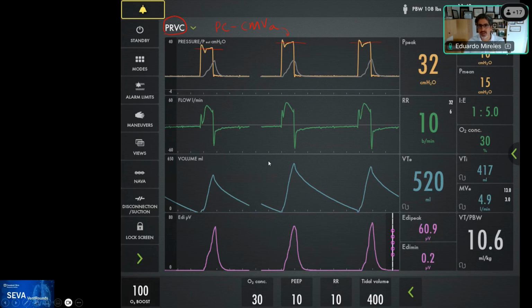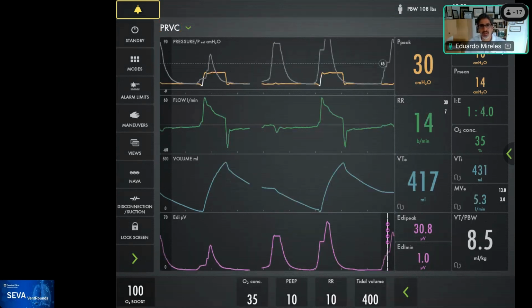So now let's go to our next image. This patient, we placed the catheter because the goal of the team was to get her to comfort, and as she was coming out of the level of sedation, now you can see her doing the activity on her own. And this is an important item for you. Remember, this is the estimated pressure at the NAVA level that was set. The NAVA level that had been set on the screen, when you press NAVA and insert the catheter, was 1. You can see that this looks very high, and that would be a very high pressure that the patient would receive. But there's a pressure limit at 45 here, so the patient should not get more than 40, and I'll show you how that looks.